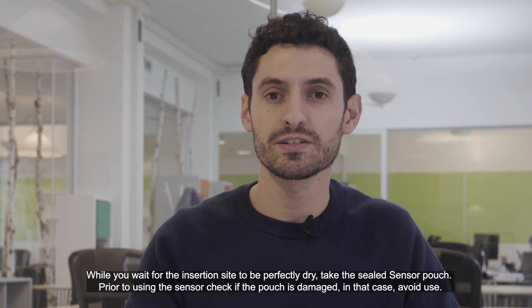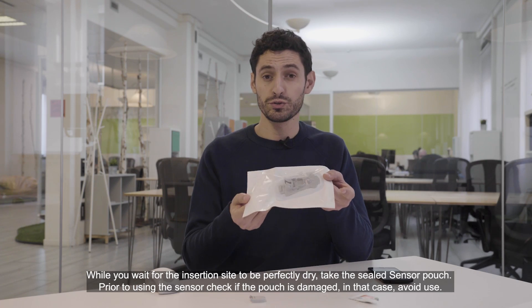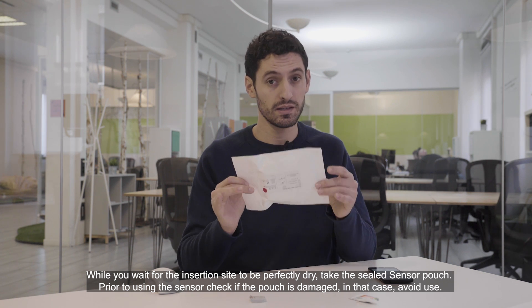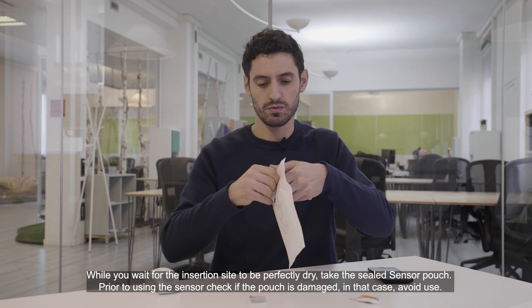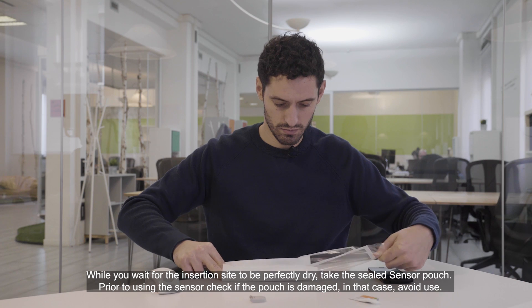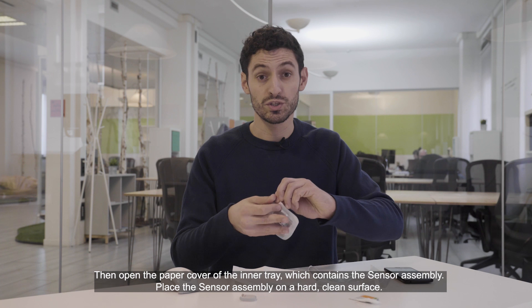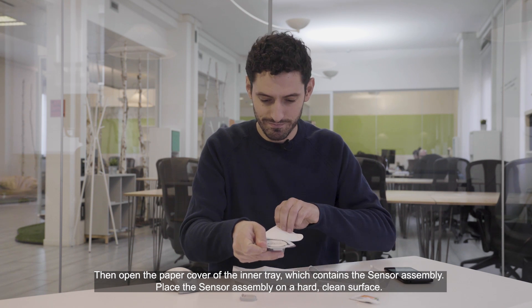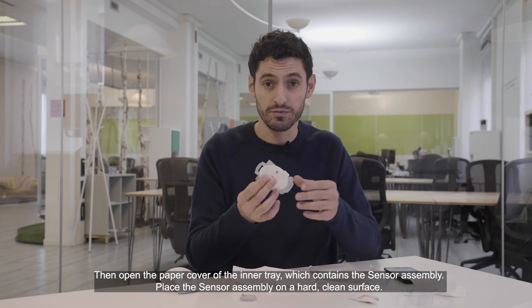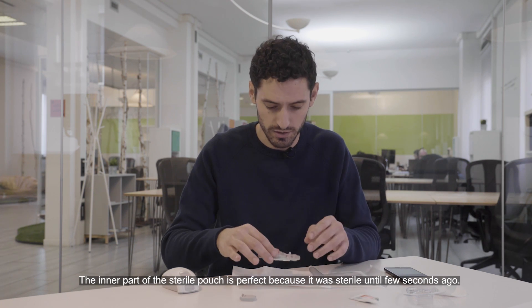While you wait for the insertion site to be perfectly dry, take the sealed sensor patch. Prior to using the sensor, check if the pouch is damaged — in that case avoid use. Then open the paper cover of the inner tray which contains the sensor assembly. Place the sensor assembly on a clean, hard surface; the inner part of the sterile pouch is perfect because it was sterile until a few seconds ago.